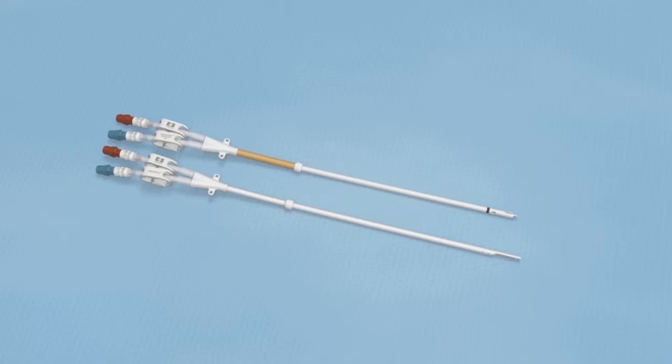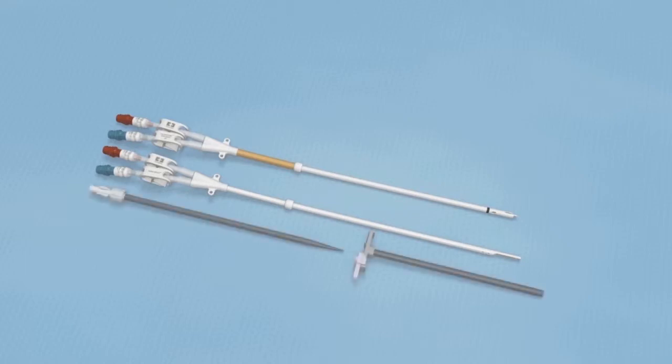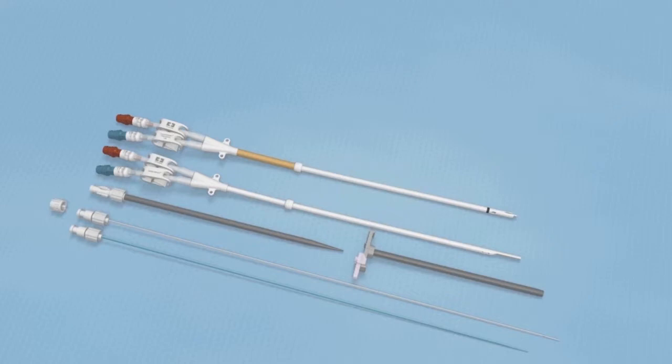Each catheter configuration includes 1 valved pull-apart safety sheath, and to accommodate over-the-wire or sheathless insertion techniques, 2 TAL VenaTrack over-the-wire insertion stylets are available if desired. Both options are available to accommodate the preferred insertion technique. The valved pull-apart sheath and the TAL VenaTrack insertion stylets are both designed to reduce the risk for air embolism and blood loss during catheter insertion procedures.